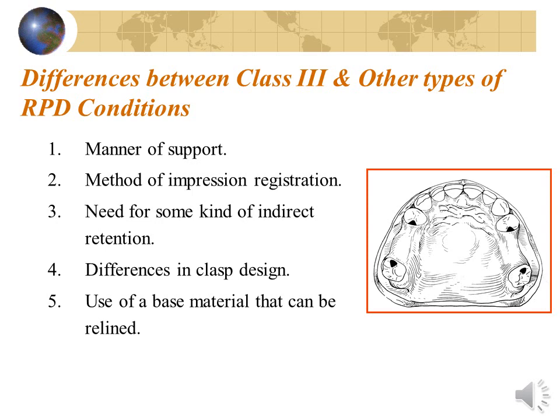Cast clasps of either circumferential design, bar type, or combination clasps may be used depending on how one can modify the surfaces of the abutment teeth. Denture base materials that can be relined are used in situations like recently extracted teeth, but bases made of metal are usually recommended.